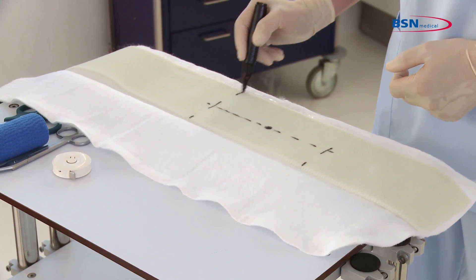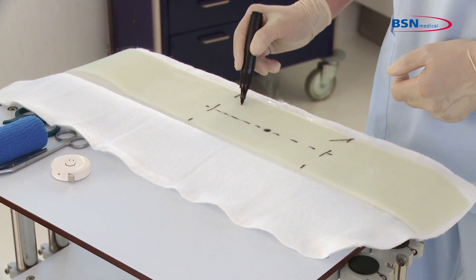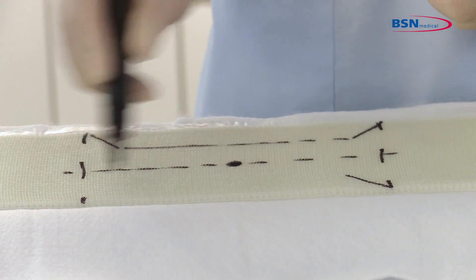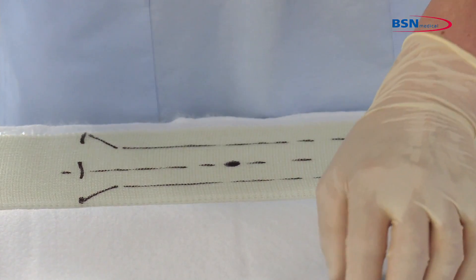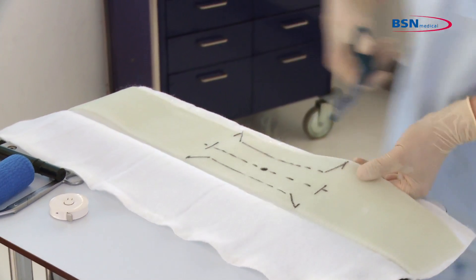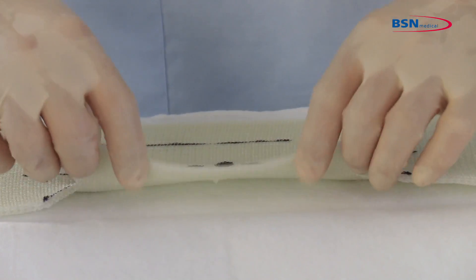Divide these two fields in half again and mark the edges of this cutout diagonal. Cut these four lines and fold the butterfly in towards the middle of the substrate at a curve. This creates a reinforced yet open area.